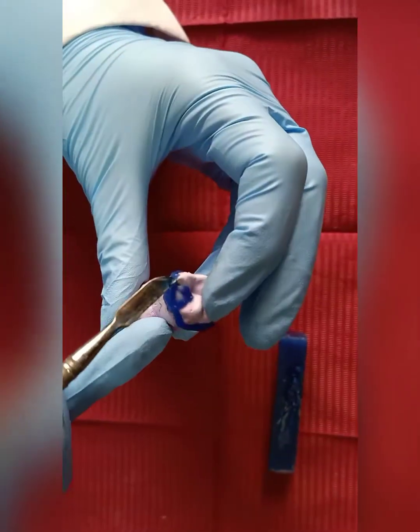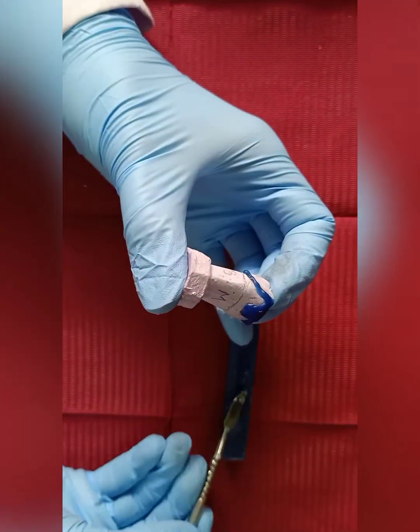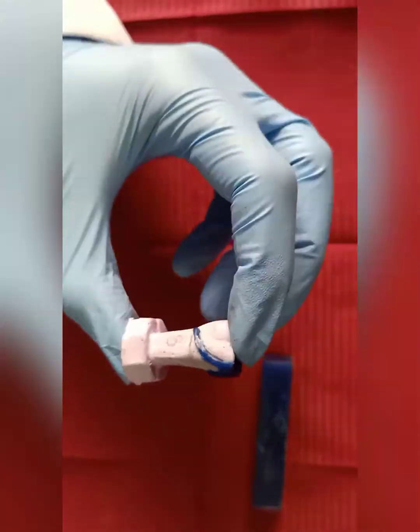And it's almost done. Just fill any spaces that need wax. Give it proper thickness.